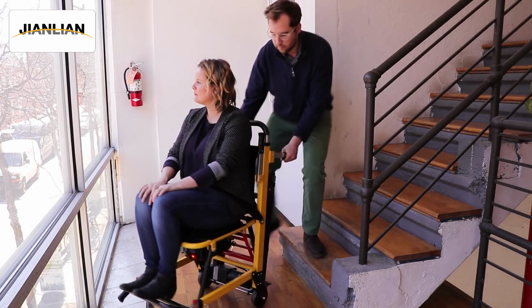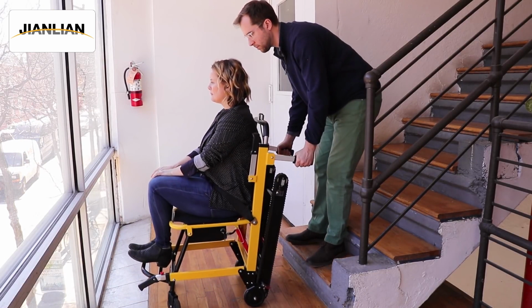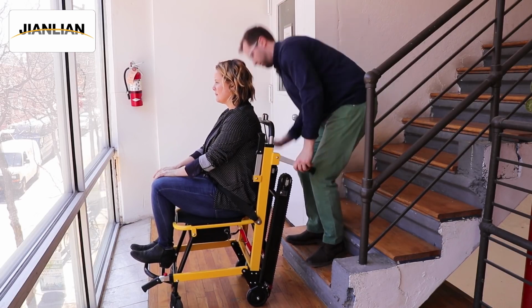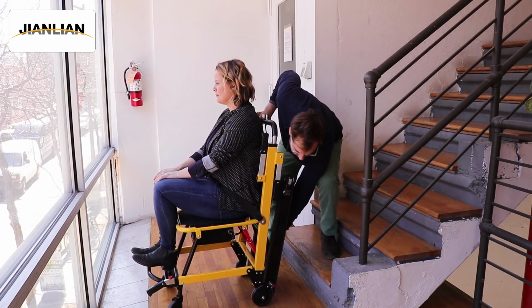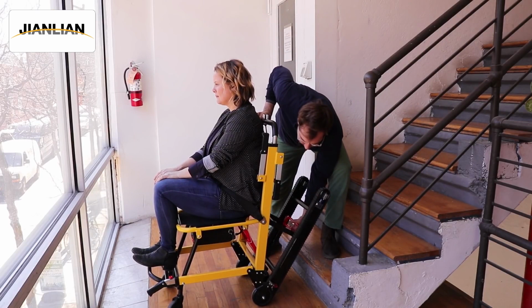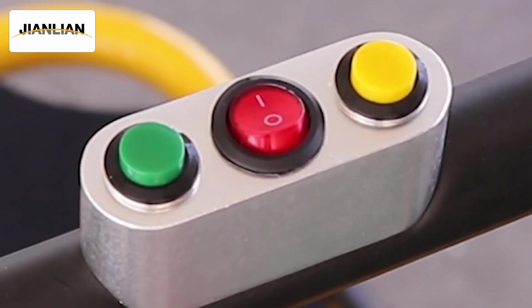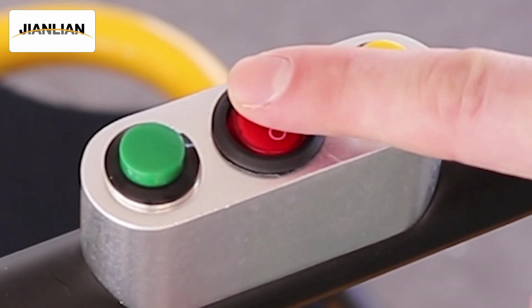To ascend a staircase, back the stairlift up to the staircase and stop when the treads are approximately 10 inches from the bottom stair. Push the red track handle towards the arrow to pull the track away from the stairlift until it locks into place. Power on the stairlift by flipping the red switch on top of the handlebar to the on position. The red switch can be switched off to stop the stairlift at any time.